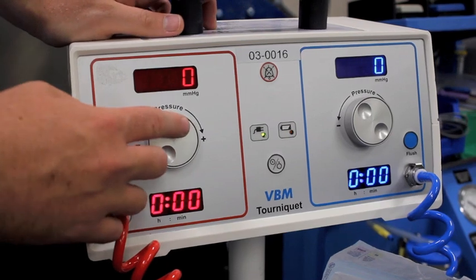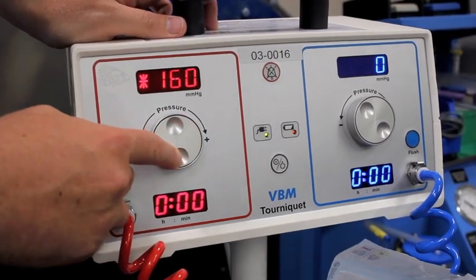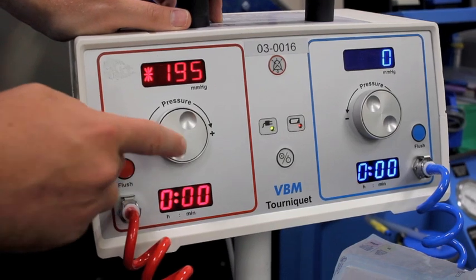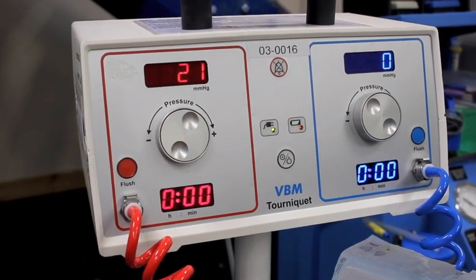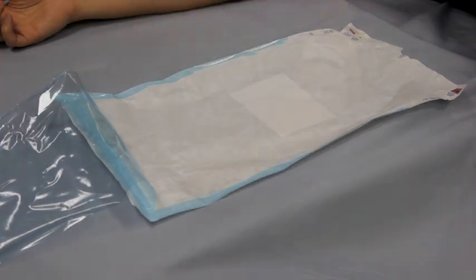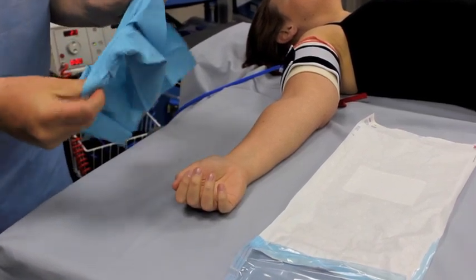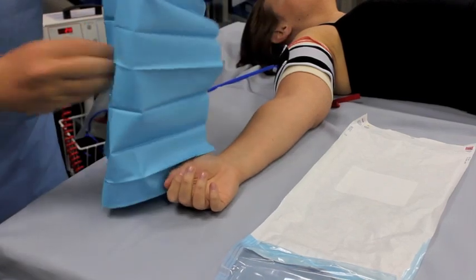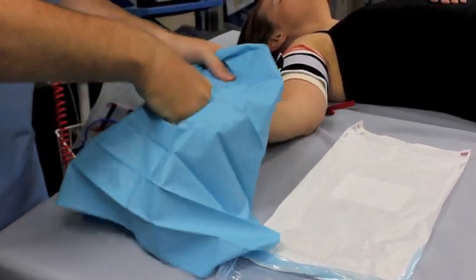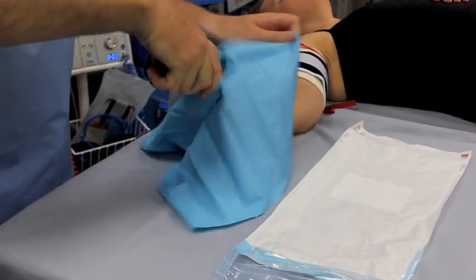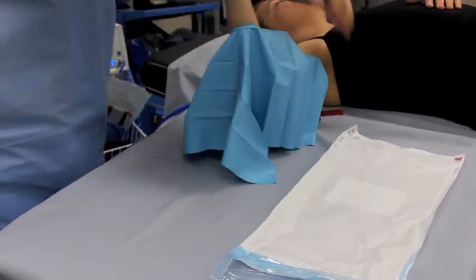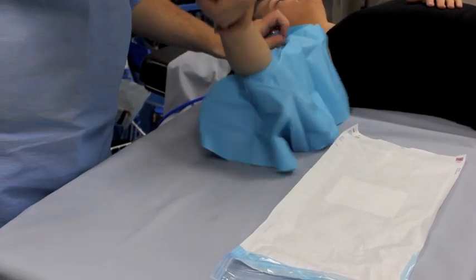Pressure should be set appropriately to inflate the tourniquet cuff according to the patient's preoperative systolic pressure. The final stage before skin preparation is to apply the tourniquet drape. It provides a waterproof barrier which protects the patient from burns associated with skin preparation without creating its own tourniquet.